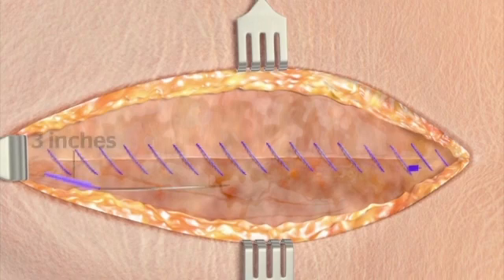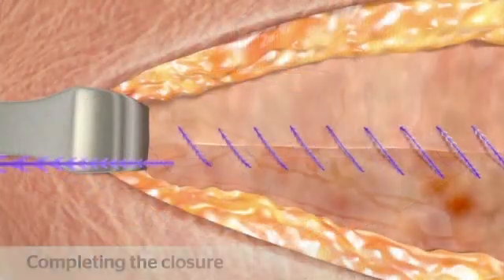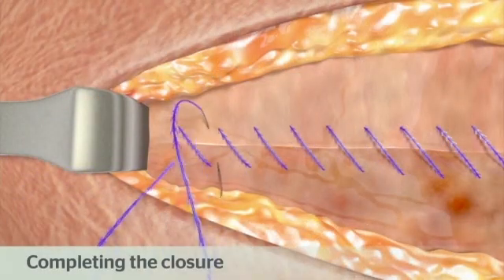take two passes in the reverse direction across the incision. Then gently pull on the free end of the device and cut flush with the surface of the tissue. Closure is now complete.